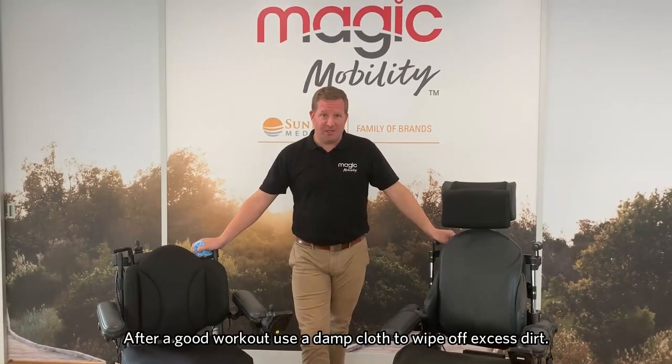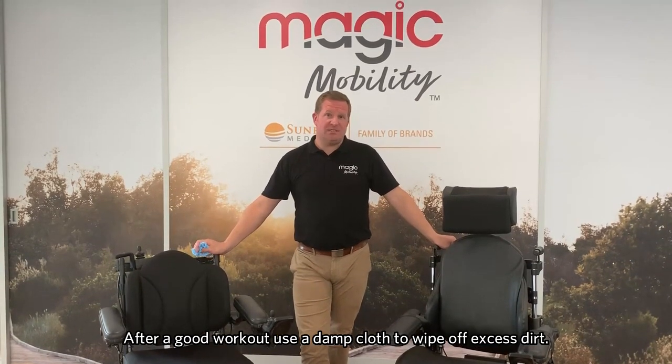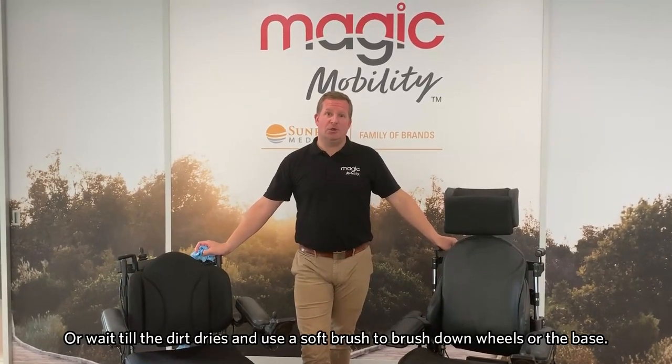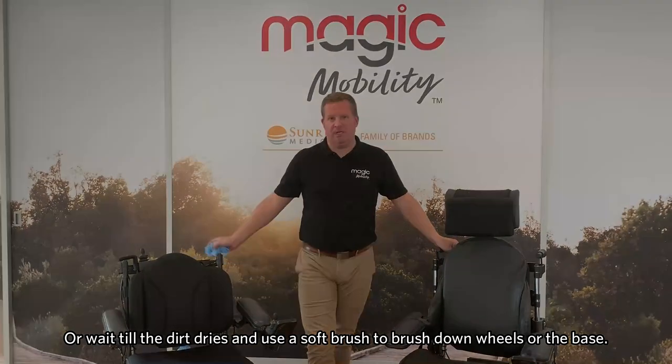When you've given the chairs a good workout during the day and they are excessively dirty, we suggest using a damp cloth to wipe off any excess dirt, or waiting until the dirt has dried and then using a soft brush to brush it off components such as the wheels or the undercarriage of the chair.